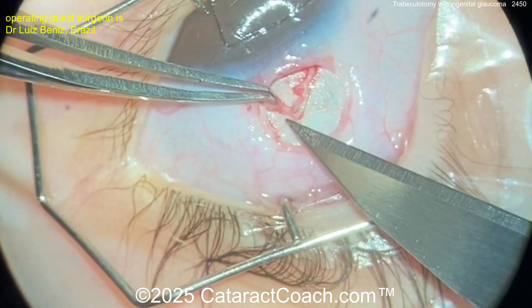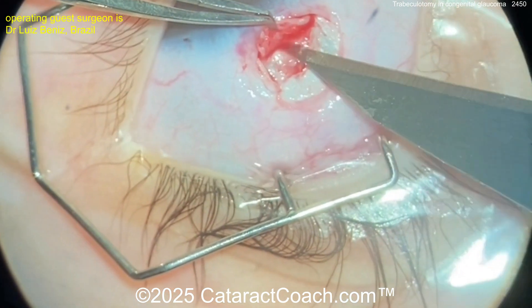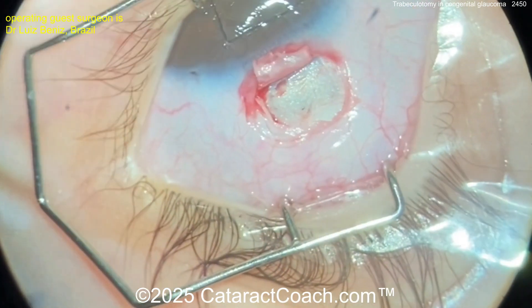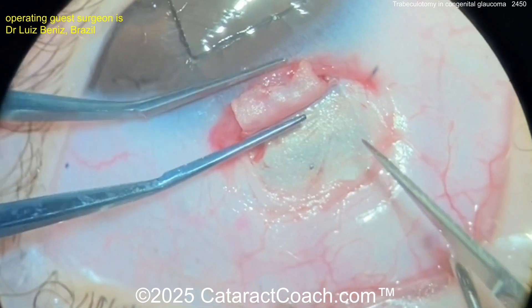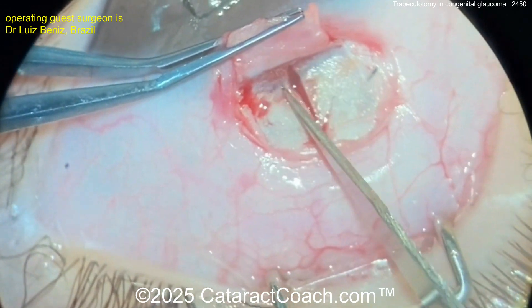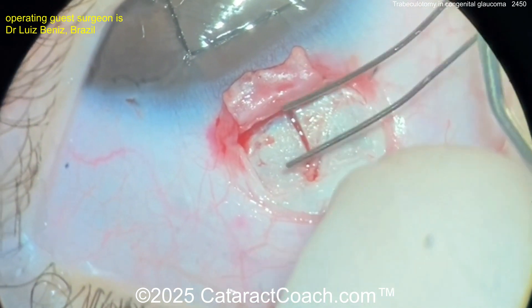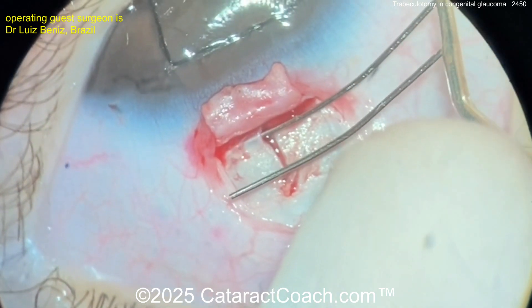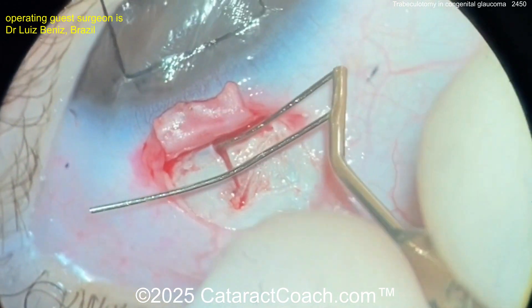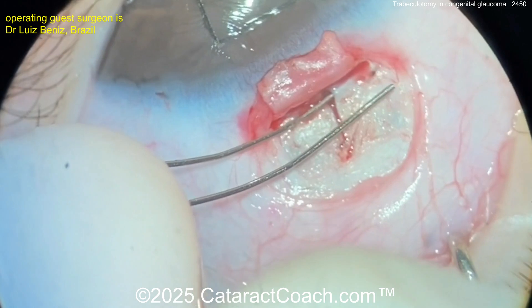Using an 11 blade, cutting across here. Remember you want about half scleral depth. Now we need to basically cannulate the trabecular meshwork and Schlemm's canal. Here we go — cutting across looks good. Slowly, slowly, slowly cutting down — you've got to be very careful here, pushing left and right just to make sure you're in the right spot. You should see a little bit of outflow of aqueous, and once you see that you know you're in the right spot. You can go inside and cannulate it very carefully — it should go pretty easily. If there's a lot of resistance, you may not be in the correct plane.